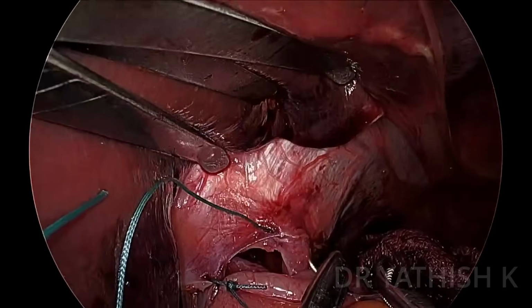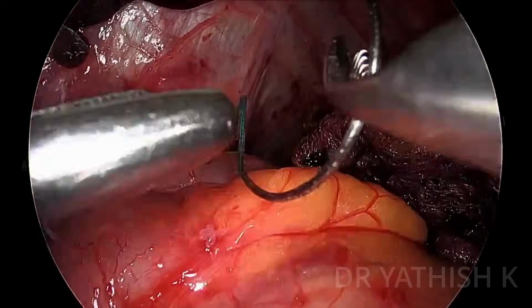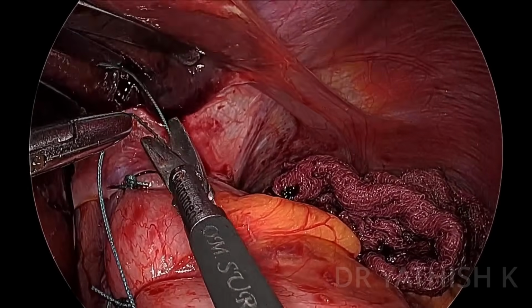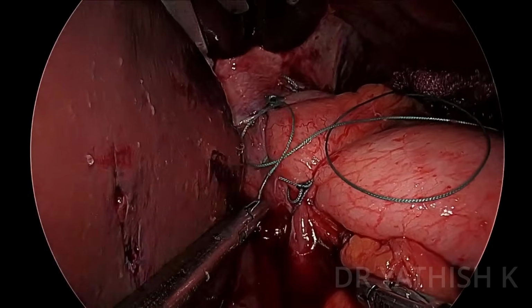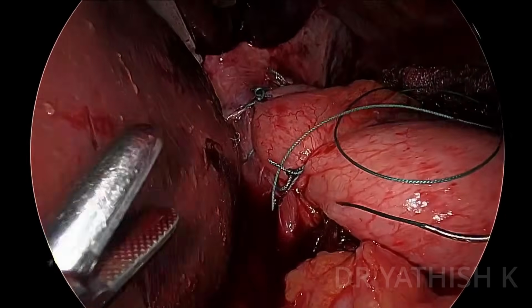Irrespectively, the principles remain the same: the wrap has to be partial and tension free, and it should cover your myotomy site without creating any obstruction. So this almost completes the wrap creation, and the next part is to have adequate hemostasis, and you have to do a check endoscopy too.